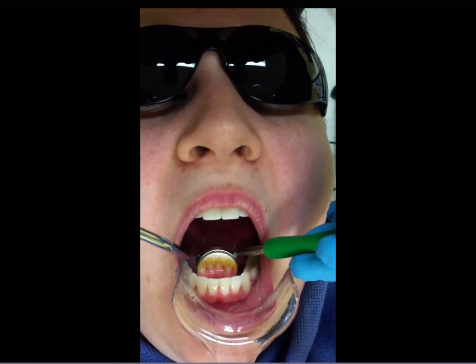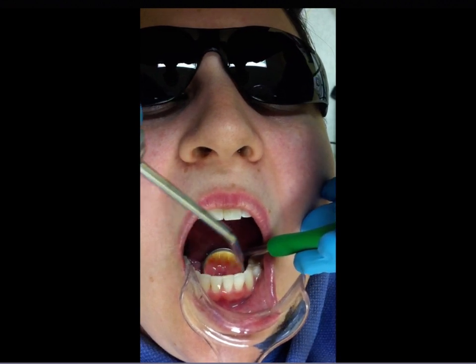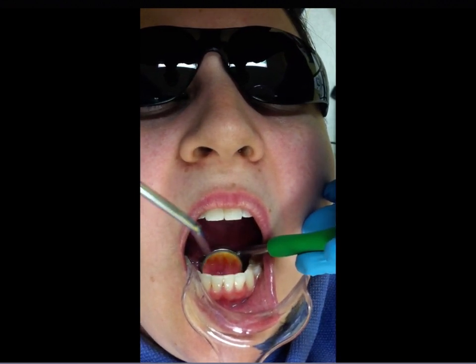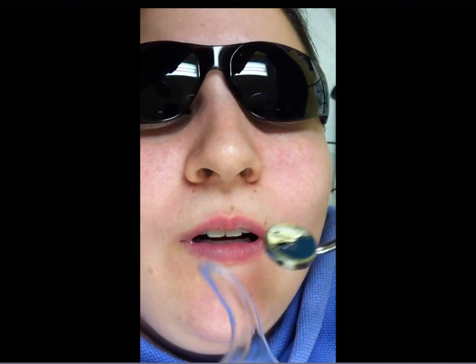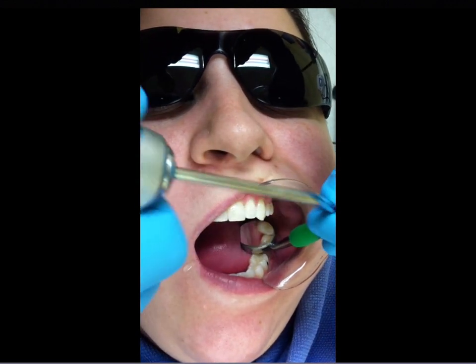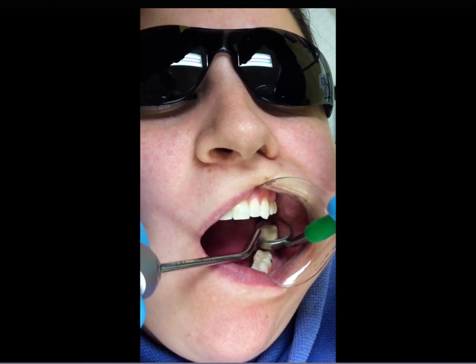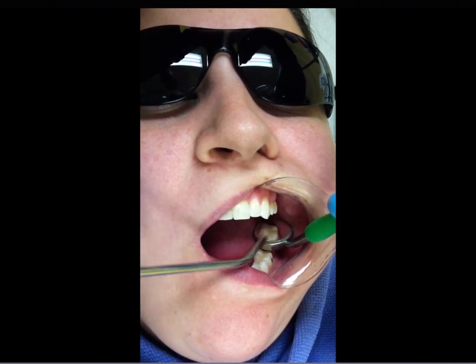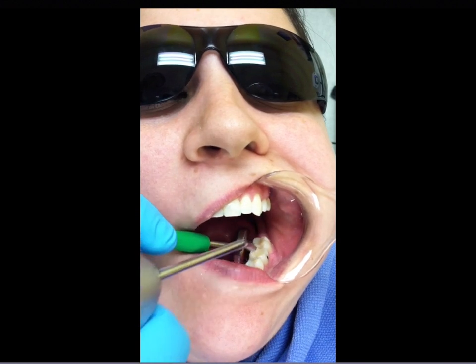Here's the Diodent mirror attached to the saliva ejector — you can hear the difference in suction; it's not as strong but it works decently. At the upper left, it's not really blocking the holes on this particular patient, but sometimes it will, and then you have no suction in the back at all. That's where the New Bird with its holes on the mirror face really shines.